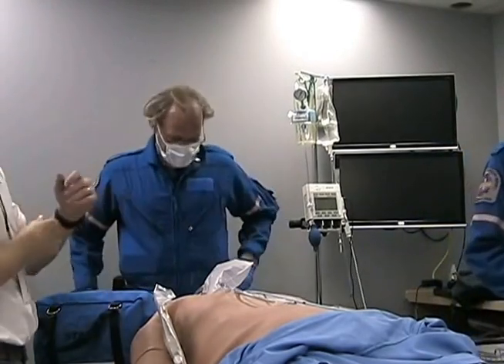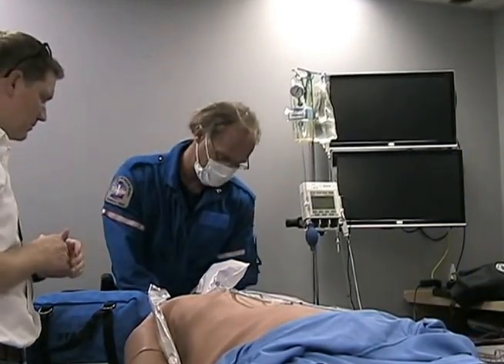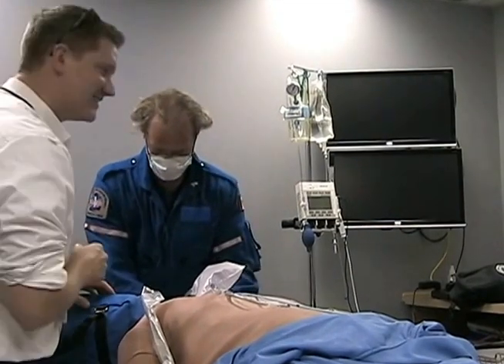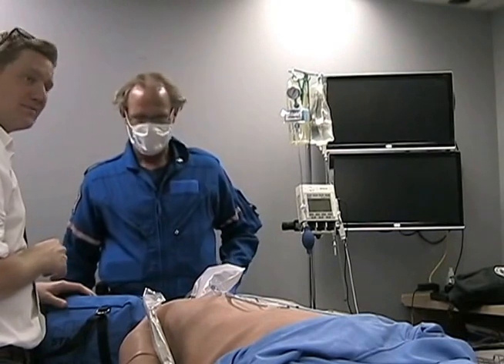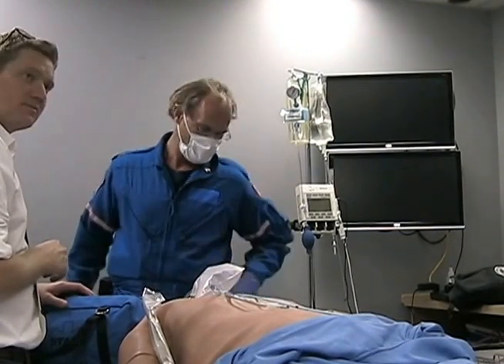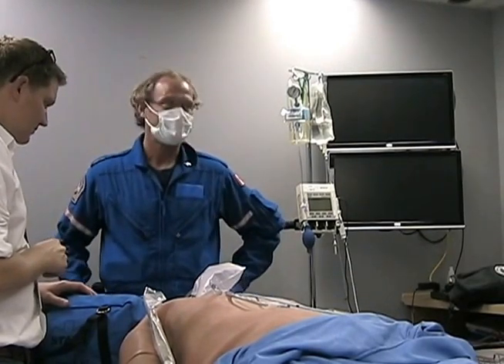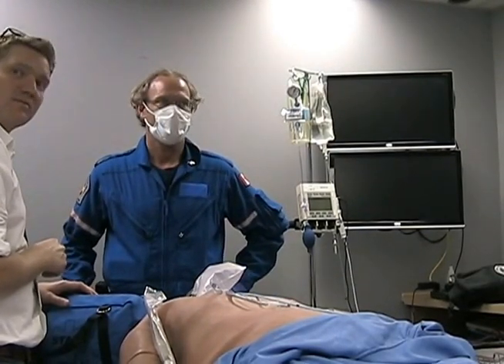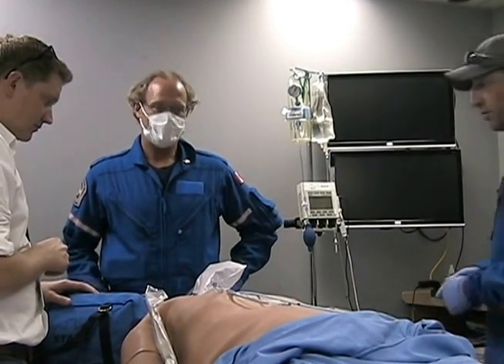Oh, hi there. Is it John? That's John. Oh, hi, John. Do you mind doing us a favor? Sure. We're just a nursing attendant, but... Oh, no, John, you're very important in this whole thing. We're just going to get you to do a checklist here, and what I want you to do is actually read out the whole checklist, just read the whole words per the line, and just wait for one of our responses. And if for some reason we missed a step, just wait till we fix it before we go on to the next step. Okay, can do. Awesome. Thanks so much for your help. Okay, whenever you're ready there, John.